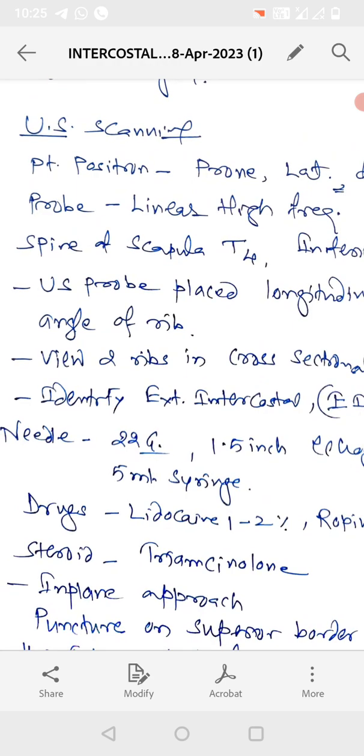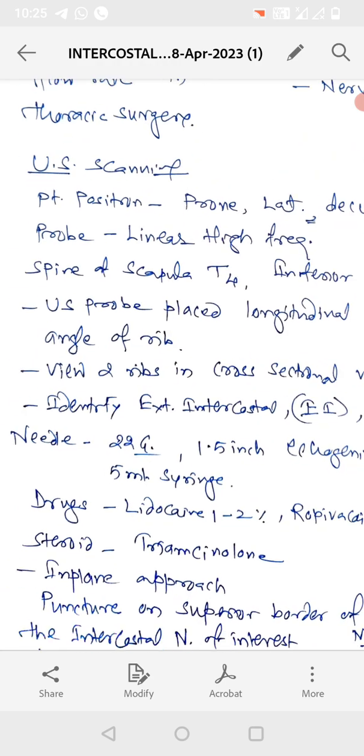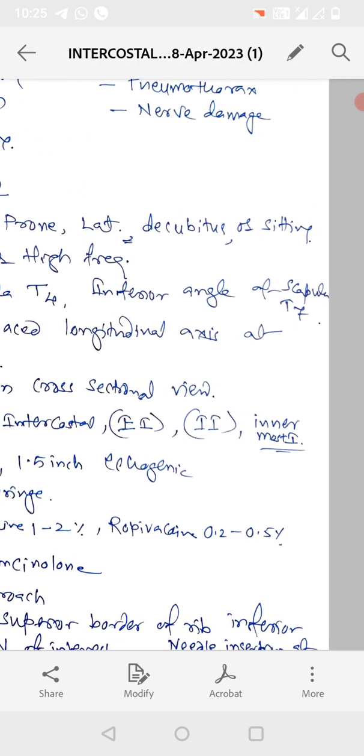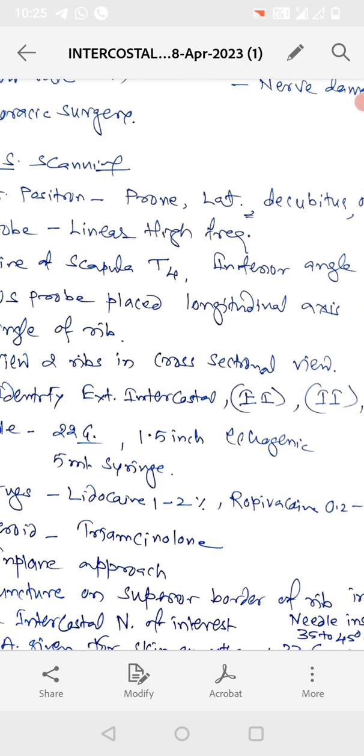Now we will see ultrasound guided scanning. What is patient position? Patient position, it can be given in prone position, in lateral decubitus and sitting position also.